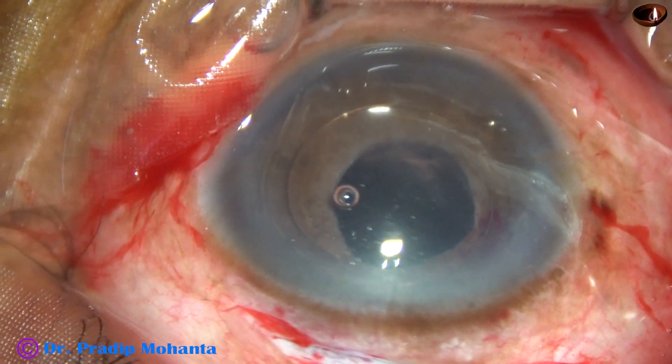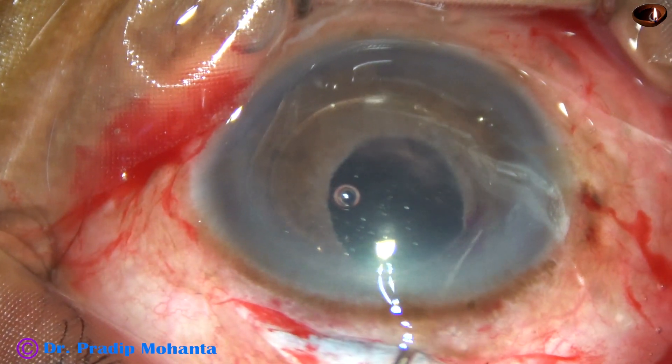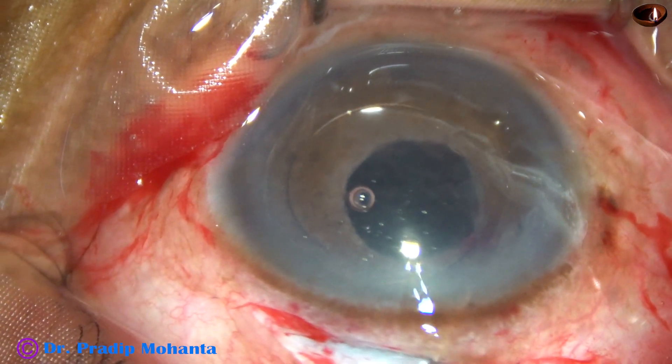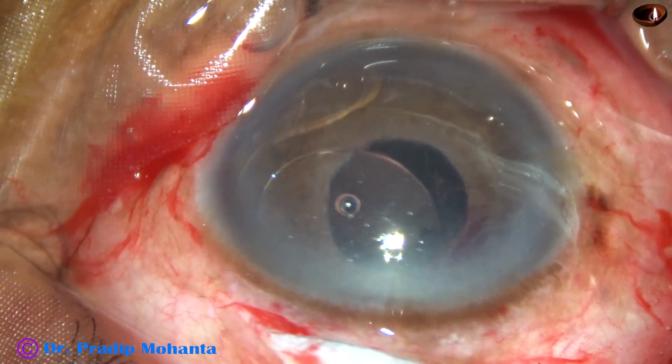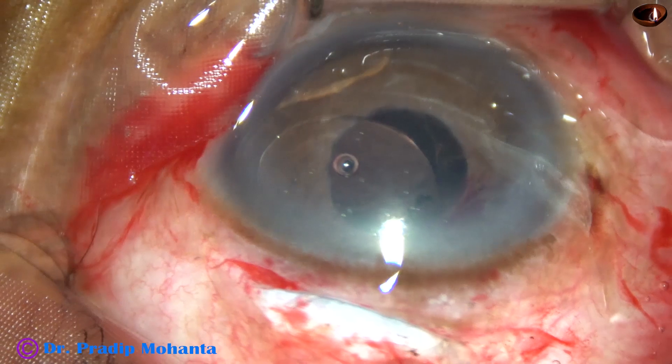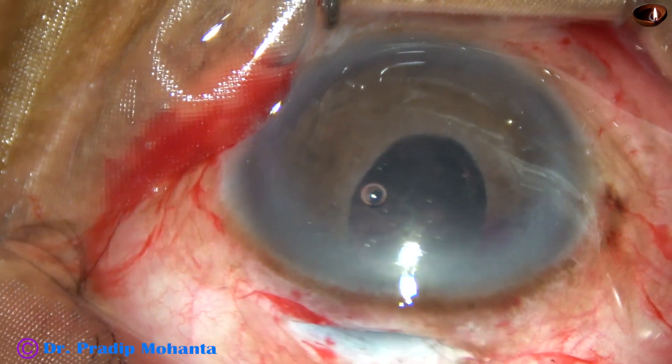I take the Sinski hook again and mobilize the haptic at 9 o'clock, and it comes out. Now with the help of McPherson's forceps, I remove the lens.